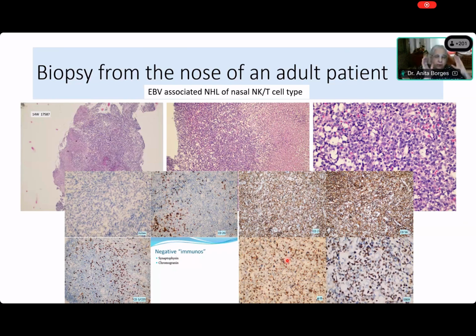So what is this particular case and the mucosal melanoma case saying to you? That tumors may start out as poorly differentiated malignant tumors where we don't see differentiation. We are not able to make a diagnosis because we don't see keratin or squamous features, or any idea that this may be a carcinoma or a sarcoma. It's totally lacking any differentiation, so we use this very non-specific term for an undefined tumor on H&E, and we call it a poorly differentiated malignant tumor.